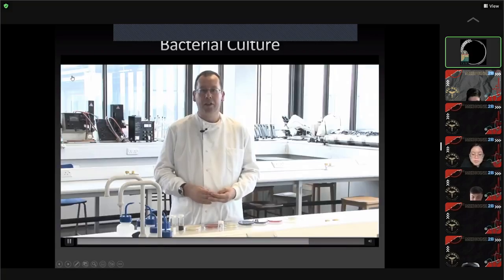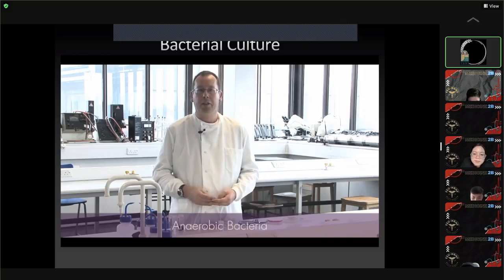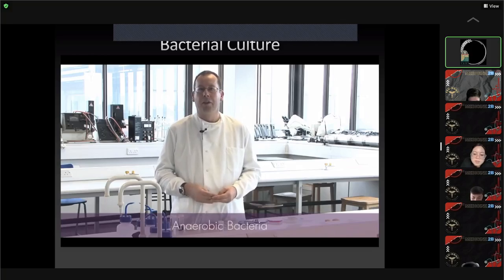After 24 hours in cooked meat, bacteria present in the sample have had the opportunity to multiply, increasing their numbers, and so there is a better chance of recovering them on solid media. So this technique is important as it is improving the sensitivity of culture. This is especially useful for the isolation of anaerobic bacteria, as they may become injured due to exposure to air when the sample was collected.